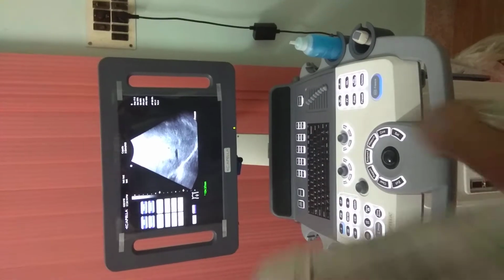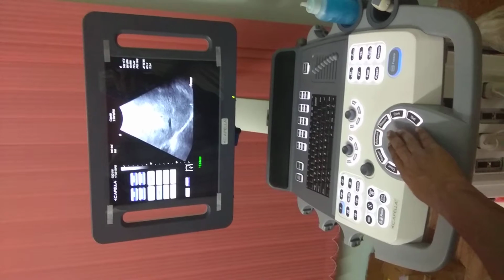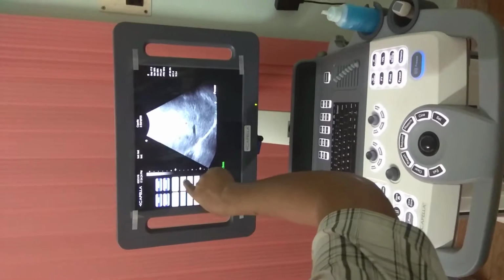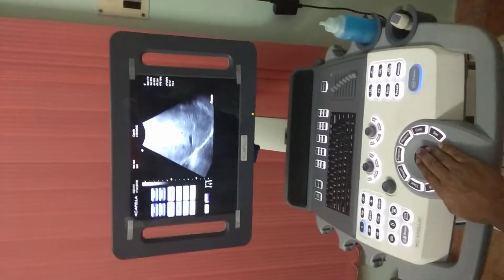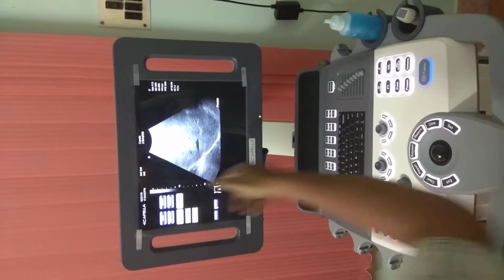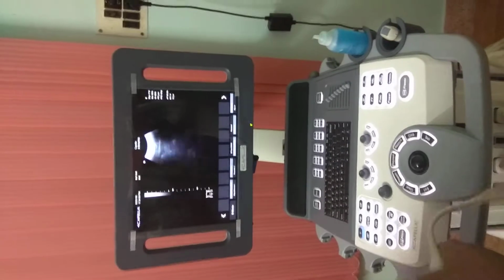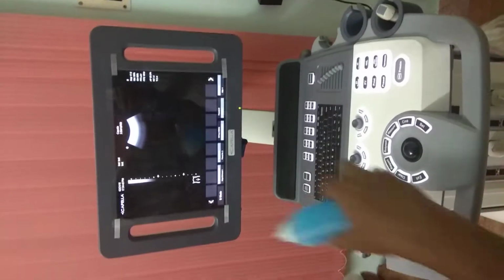like this way. Or if you just want to see the different reporting parameters, you have like liver, gallbladder thickness. This is wall thickness, this is gallbladder, portal veins, spleen, and there are other various measurements like right kidney and left kidney, volume and cortex. So for example, if you go for kidney, let's just measure the right kidney. Let's just apply some more jelly firstly.